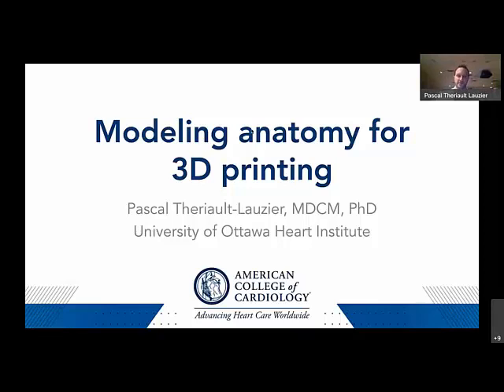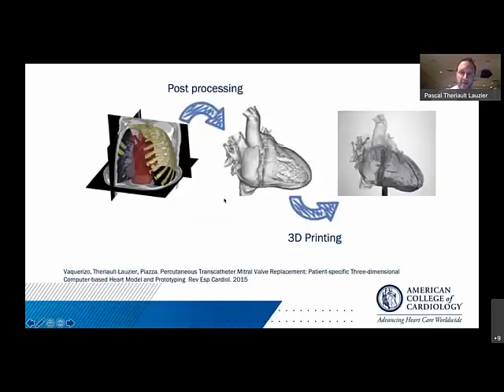So I wanted to touch base a bit more on the technical aspects involved in 3D printing and modeling anatomy and how this is done on the software. And so I have no disclosure for this presentation. So what I'd like to go through is the process that takes us from a CT scan all the way to a 3D printed model. And this is not necessarily a trivial process.